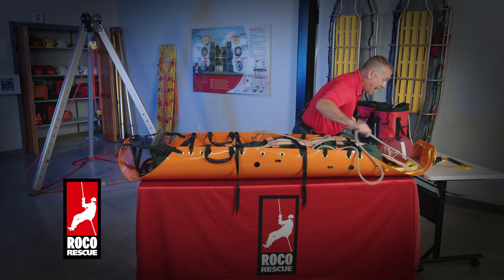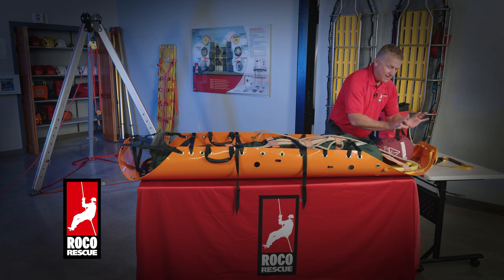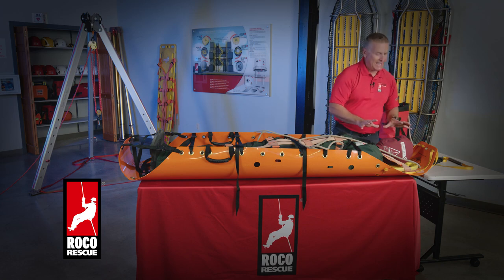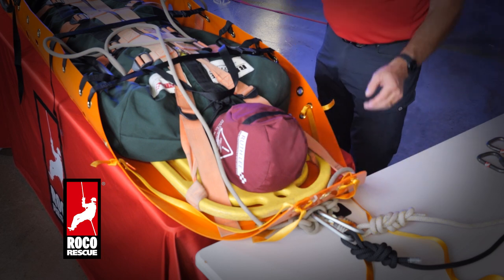Now I'm going to pull this tight. I've got this backboard up against those grommets, so that becomes my pivot point, which reduces the chance that this flexible litter is going to push over onto the patient's head. By keeping the patient's head a little bit below the top of the backboard, the pivot point becomes that board and I find myself in a good spot.